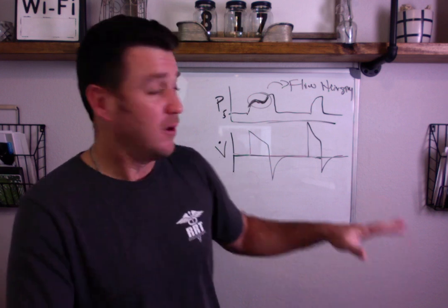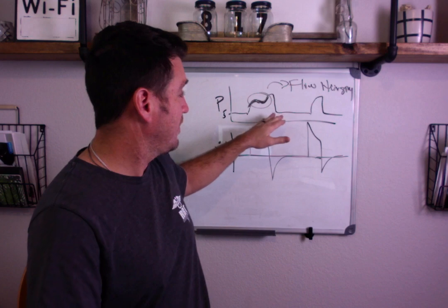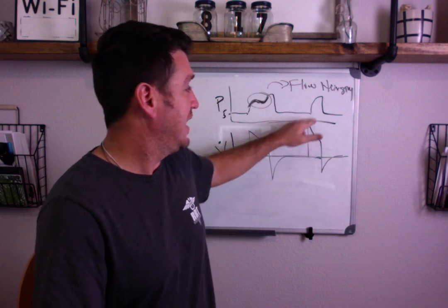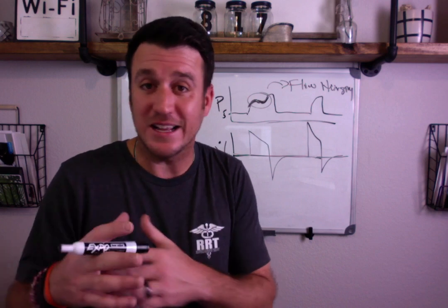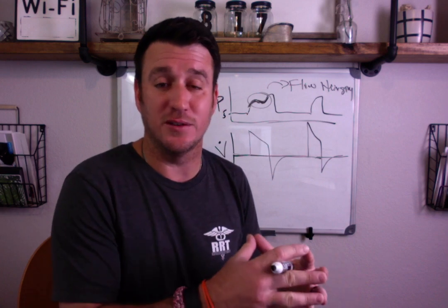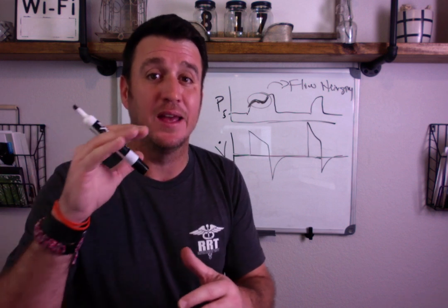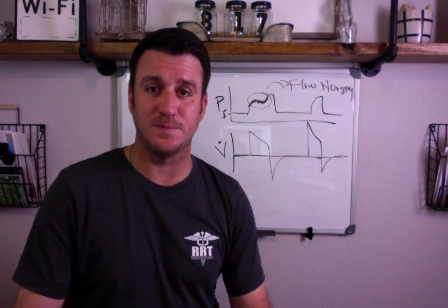So before, when we were at 60 and we were getting this severe drop in our pressure waveform, we were getting peak inspiratory pressures like 36. We increased the flow eventually to 145, and we had a peak inspiratory pressure of like 38. That's not that big of a difference when now you're meeting the needs of your patients. Now, here's what's interesting that happened. Within 30 minutes, the rate was down from 40 plus to the high 20s. Now, tell me we didn't do something good for this patient.